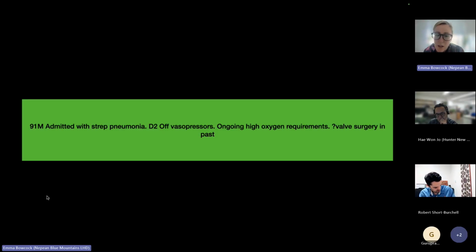And I think he's got a lot of cardiac causes that could be contributing to this being a significant cardiogenic pulmonary edema. I think he probably does have elevated LAP. The thing that I would want to see on him, which is what we ended up going to do, was lung ultrasound, and he just had B lines everywhere with relatively thin pleura, which did support more of an element of cardiogenic pulmonary edema here.